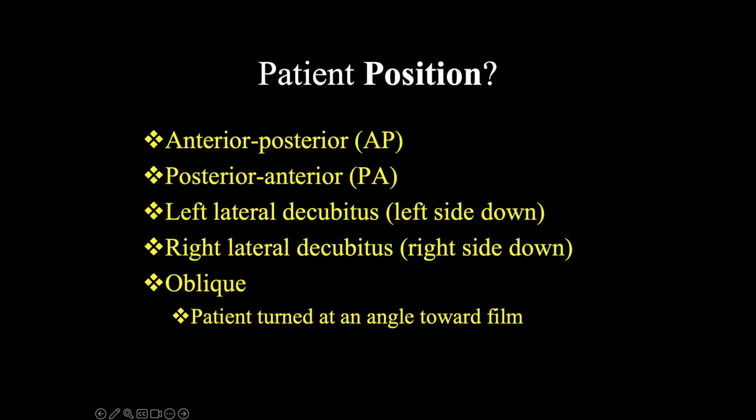So just some terminology that we tend not to think about all that often, particularly if you've been in clinical practice a while, but it's worth mentioning. Be reminded that structures closest to the actual film will have highest resolution on the image, whereas structures farthest away from the film will be enlarged or magnified. So on this next slide, I have a few examples.